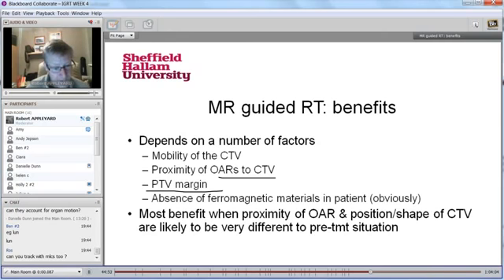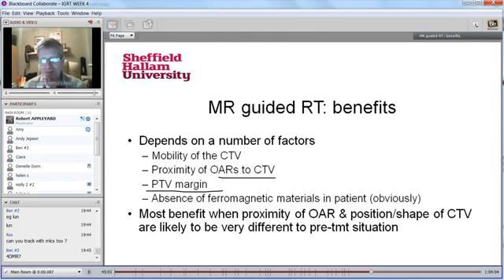As for lung, that's an interesting question, because you've got significant issues with scatter. As I mentioned earlier in this session, there are these problems with dose planning and expectations at tissue-air interfaces. Yes, exactly, tissue-air-tissue interfaces. So whether MR is perfect for lung, it's a good question. I'm not sure.